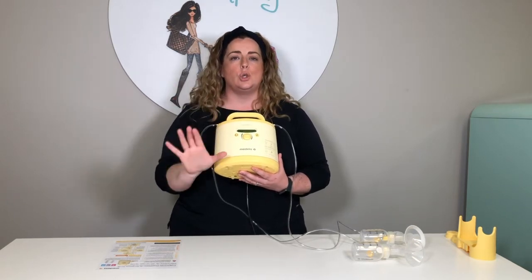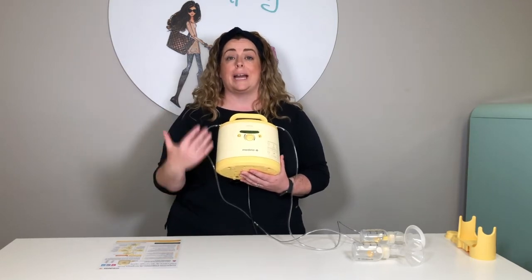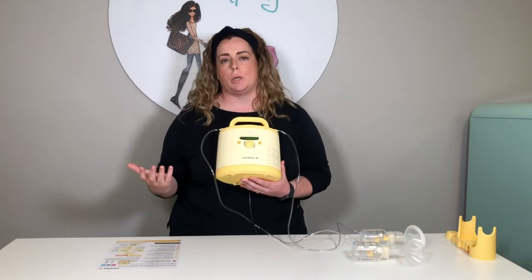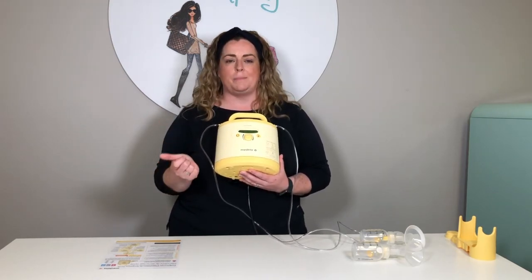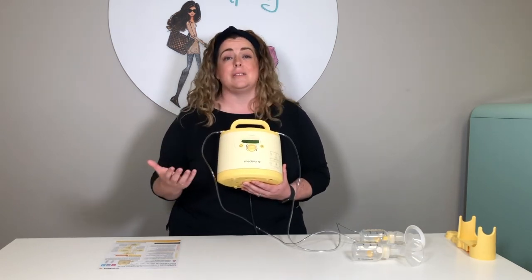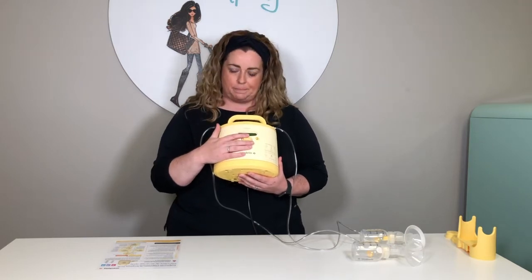That is at a good level of suction for you, which means you're able to extract the milk that you're looking to pump, because if you have too low a suction, you're not going to get what you need. But equally, you should never be uncomfortable, you should never be in pain, because if your body's in pain, it's not going to produce enough milk, it's not going to produce any milk. So find your maximum level of comfort.